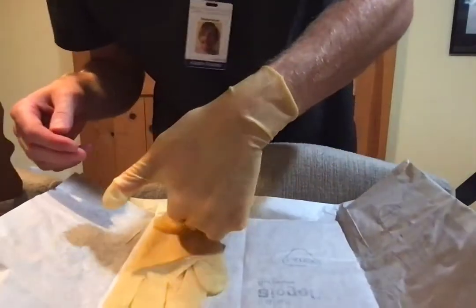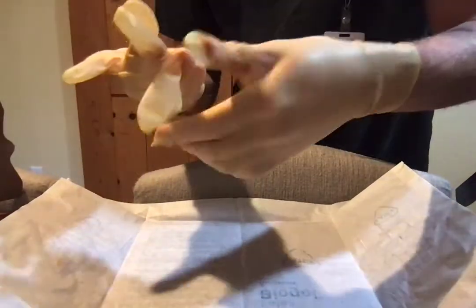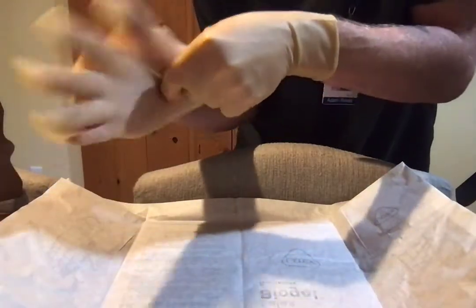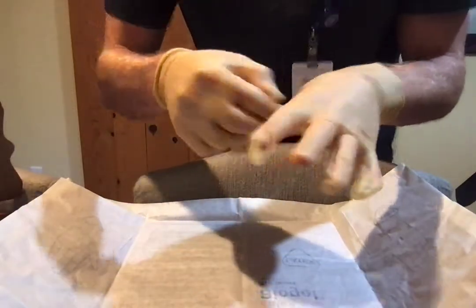These ones don't really fit all too great either, but what are you gonna do? Ideally, in a clinical setting, I would have more than just size 7 sterile gloves that I could actually fit into, because as you can see, this is quite the struggle for me, so give me a little bit of grace.